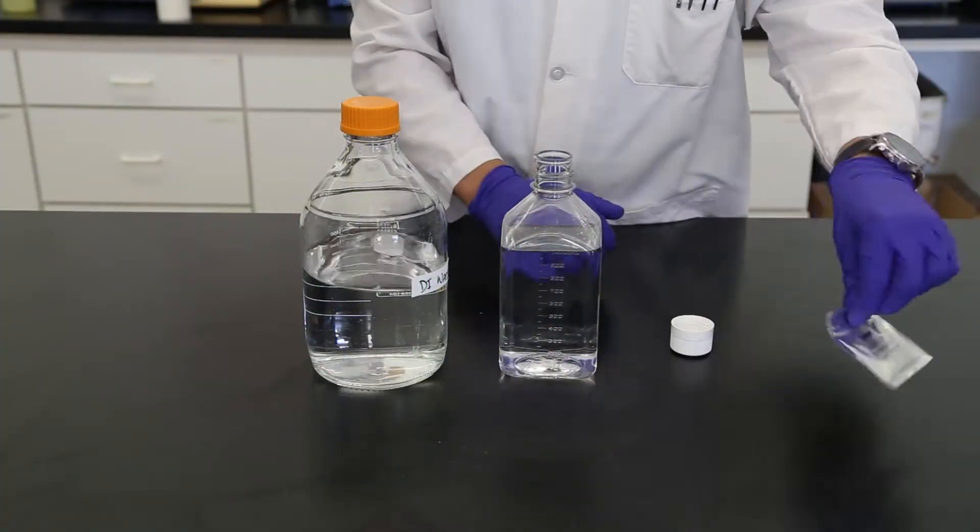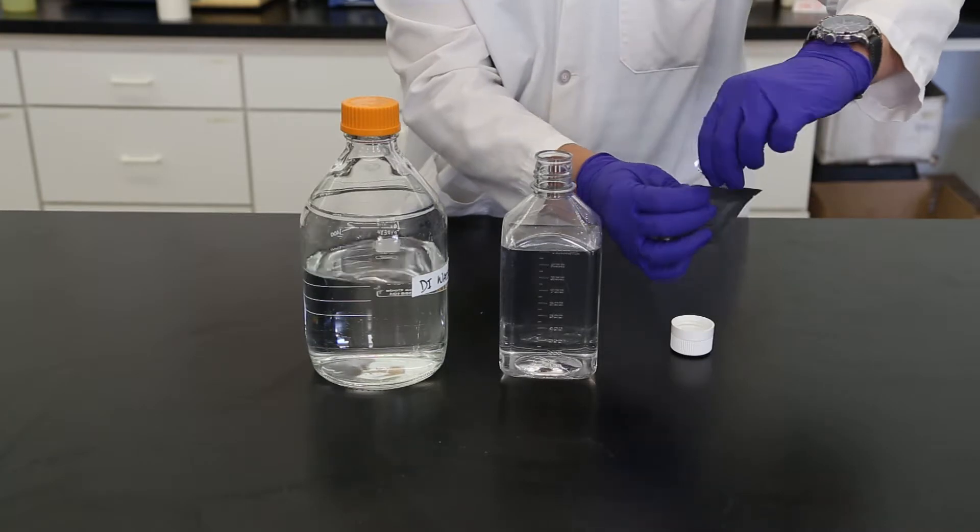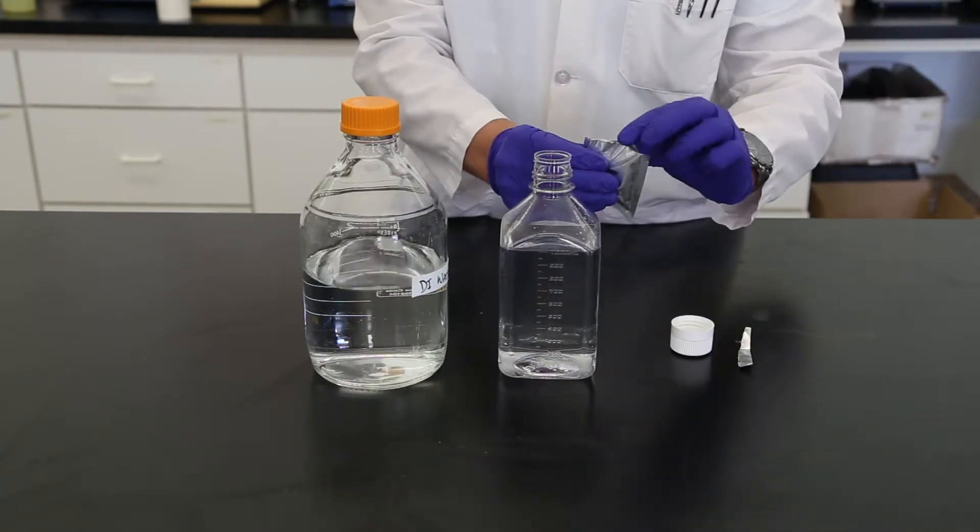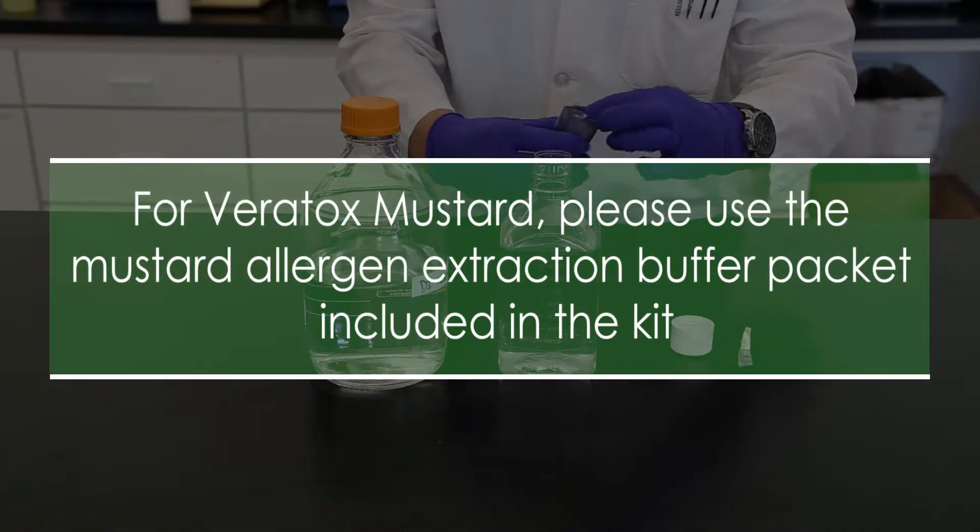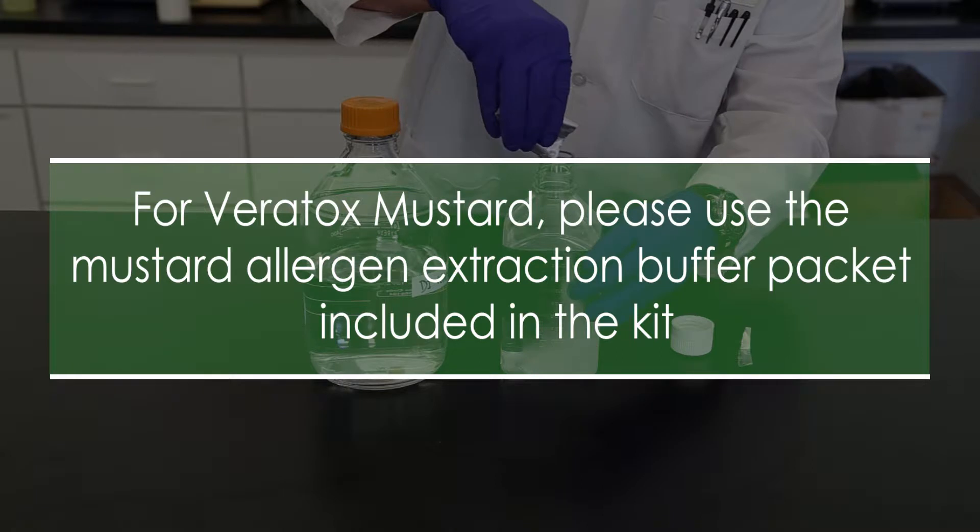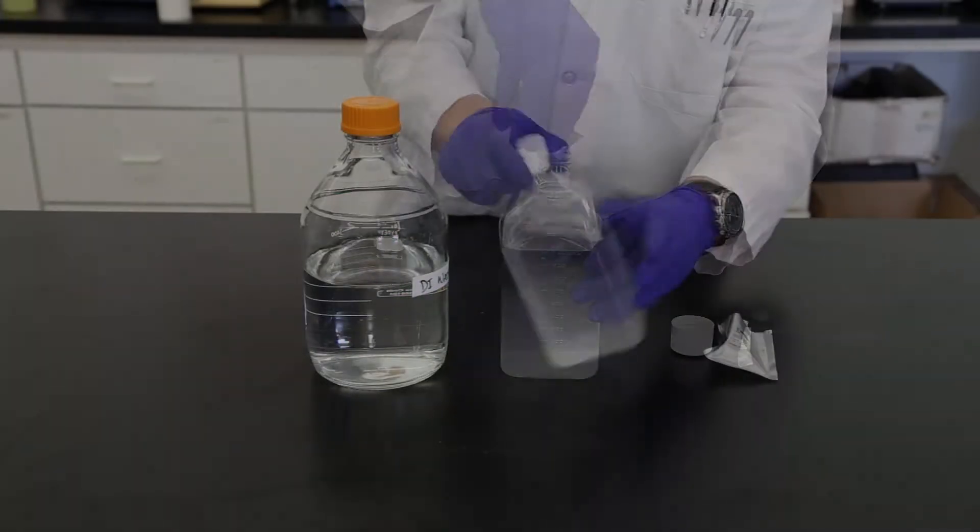Prepare extraction solution by adding contents of the PBS foil pouch to 1 liter of distilled or deionized water. Mix thoroughly.